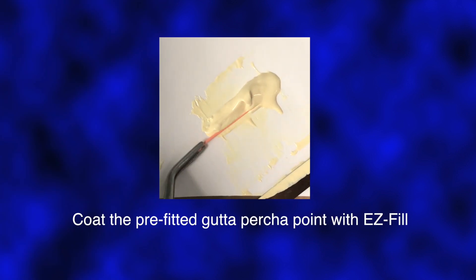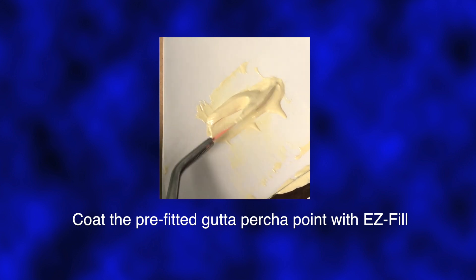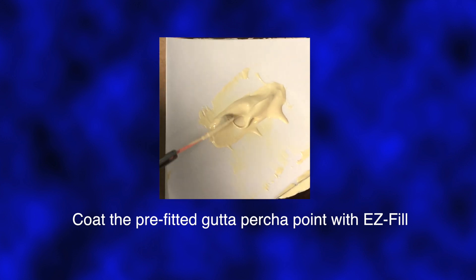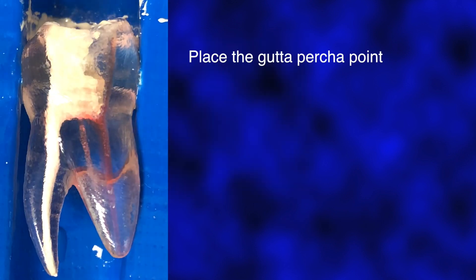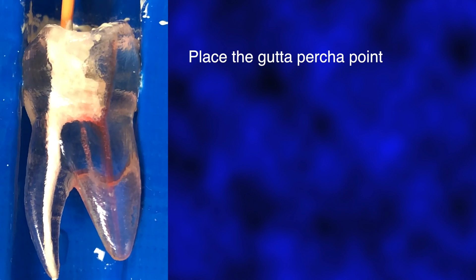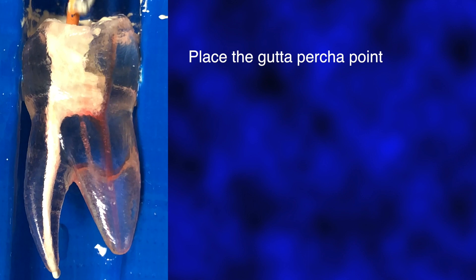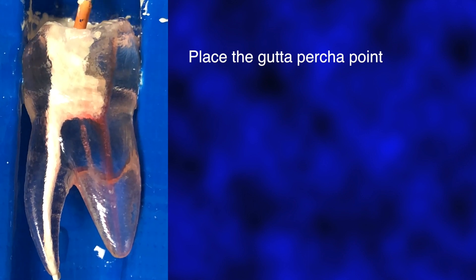Coat the apical 10 to 12 millimeters of the pre-fitted gutta-percha point liberally with cement and insert the point into the canal. Excess coronal gutta-percha can be removed by searing with a hot plugger.